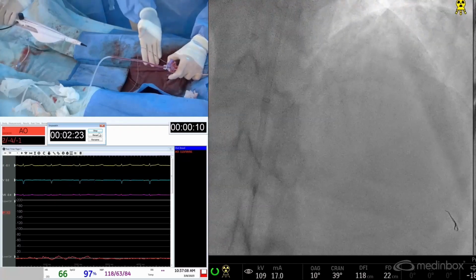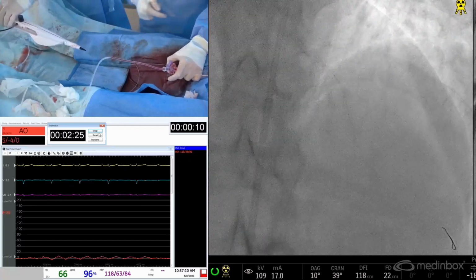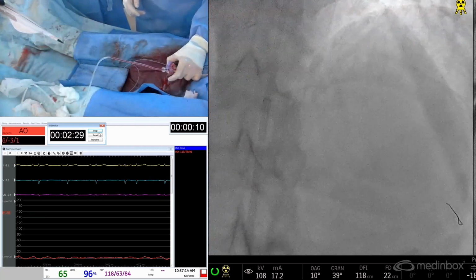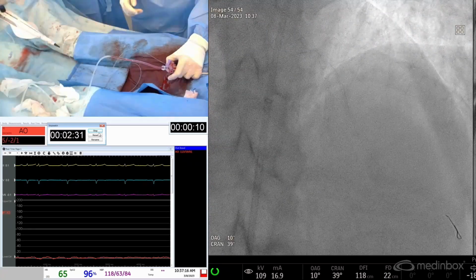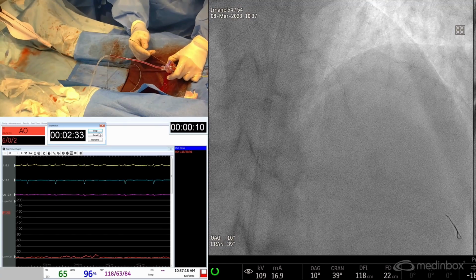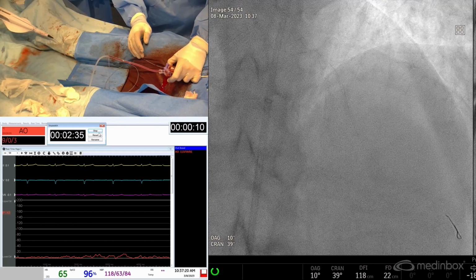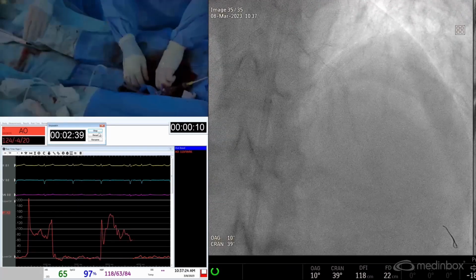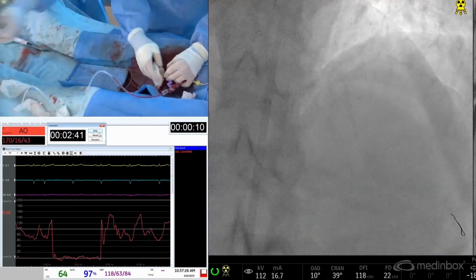I'm just going to stand here and let it snake out as most operators know how to do. This is a sort of a one-man operation. The only thing we have to be sure is to turn it off right before it splashes everyone, which will be soon. And we have it out. Very well. Right? Done.